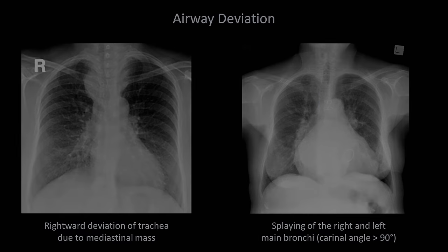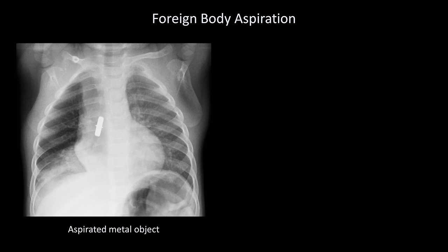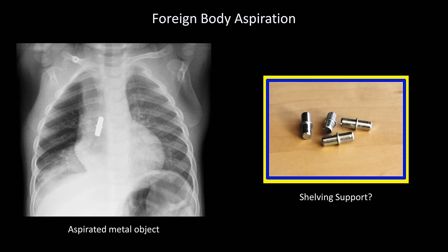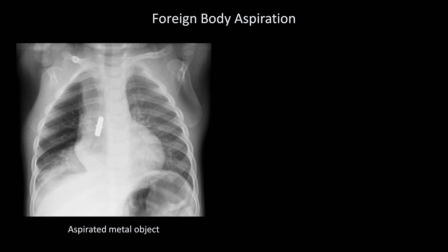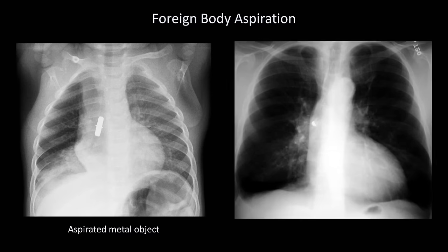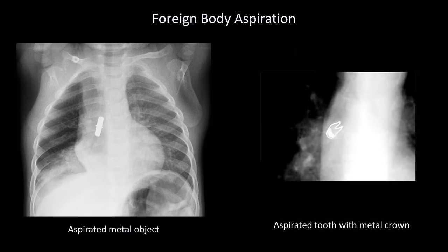The final class of possible airway abnormality is a foreign body. Here is an x-ray of a toddler who presented with wheezing and shortness of breath — there appears to be something lodged in the right main bronchus, looking suspiciously like a shelving support from a ready-to-assemble furniture brand. And lest you think only children aspirate foreign objects, take a look at this adult example: something small and dense in the right main bronchus, which when zoomed in turns out to be a tooth with a metal crown.